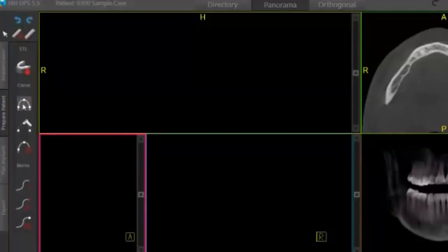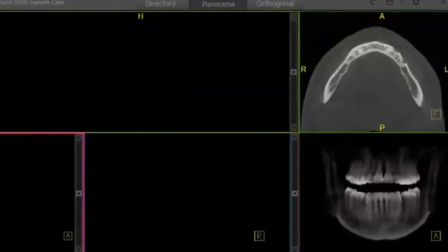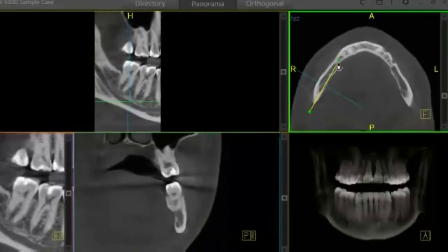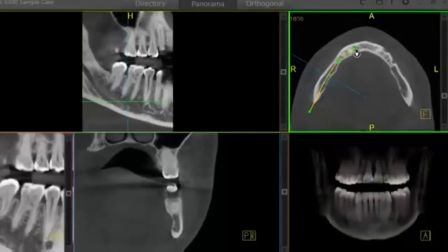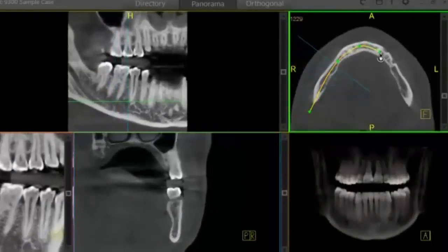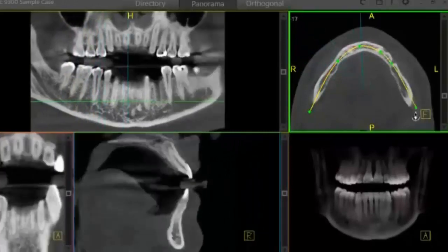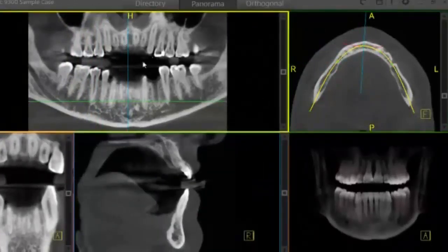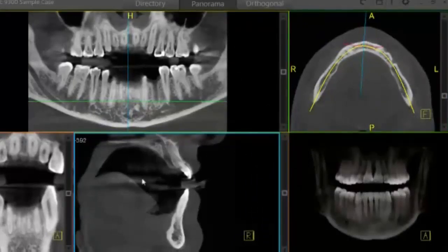To begin, I'll go ahead and draw our curve. Just select the curve tool, and I'm going to use my cursor to draw my curve through the mandibular bone. Double click to finish, and you can see now we have our pan, our cross section, and our transaxial view.